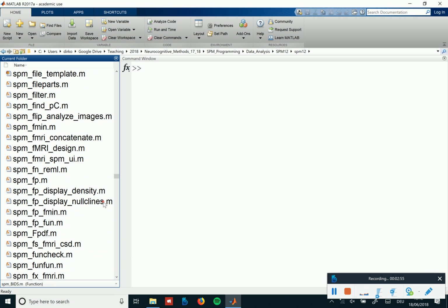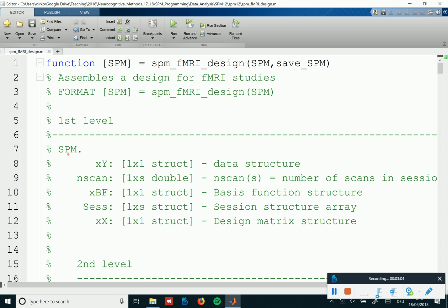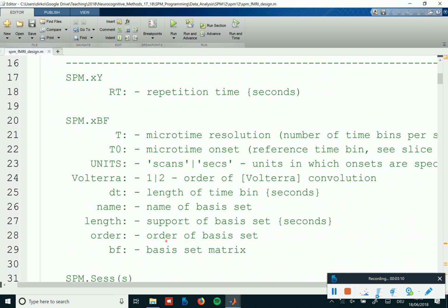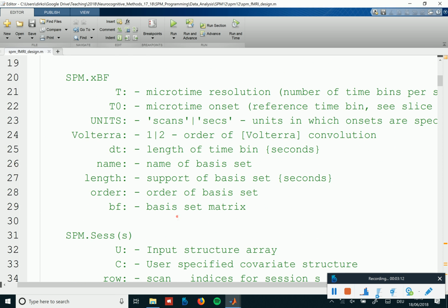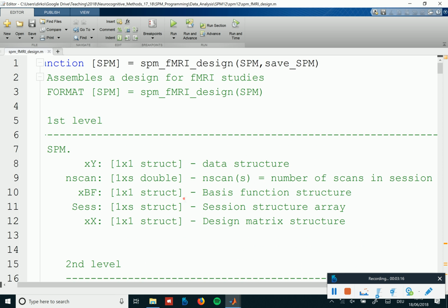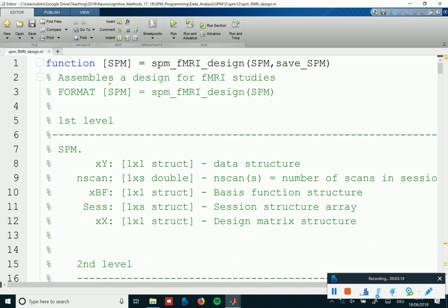And these scripts exist. So you would, for example, if you want to set up an fMRI design, basically specify the inputs for such a function like SPM fMRI design. And you need to study what these different things are that you put in. And off you went, but that really needed quite some expertise in terms of knowing what the SPM functions actually do.